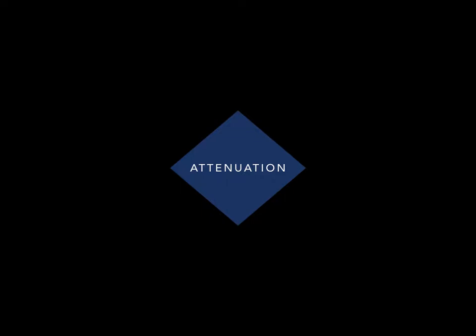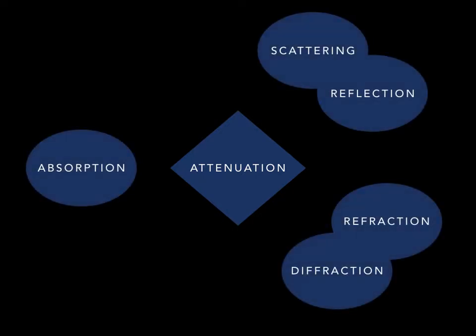Attenuation, in practical terms, means loss of sound waves and getting a quieter and quieter echo as a returning signal. This limits imaging depth. Degree of attenuation is determined by transducer frequency. The higher the frequency, the shallower the imaging depth. There are a number of factors that must be considered when we are describing the attenuation of the ultrasound beam.